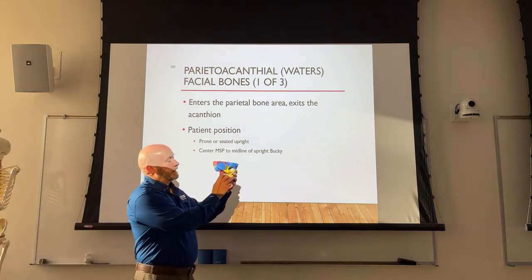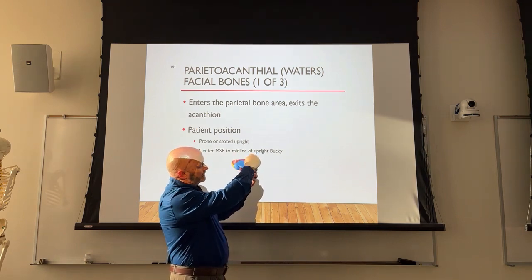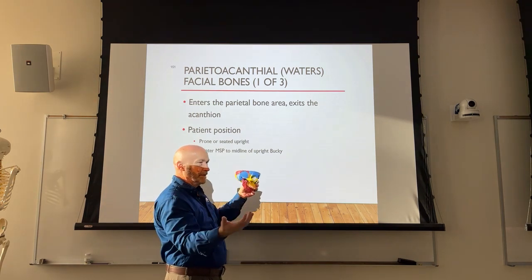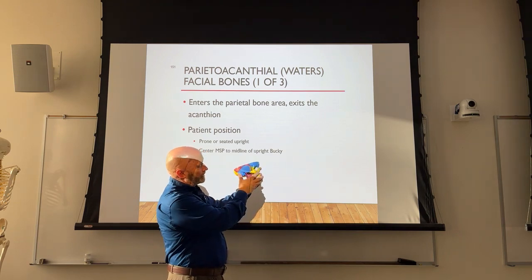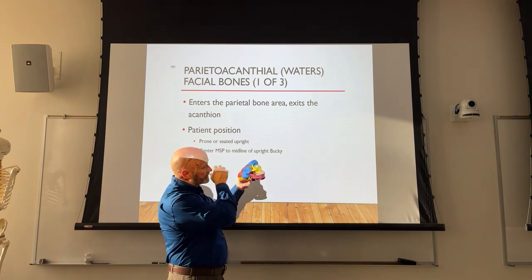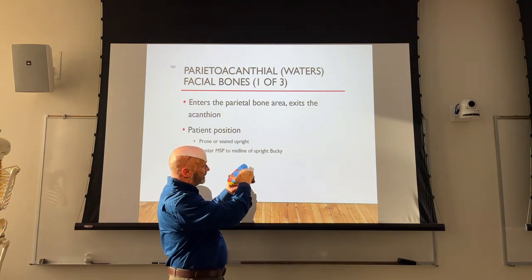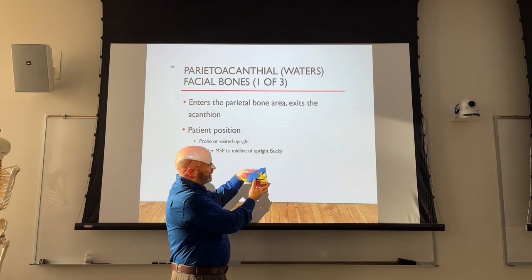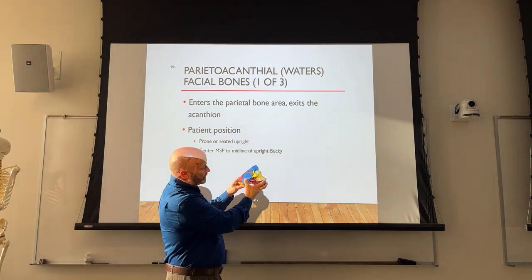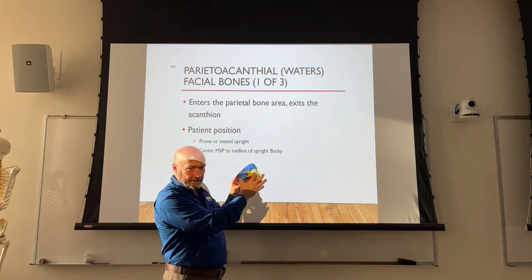Okay, so again, in Caldwell, what we're looking at is a 15 degree angle, right? And that's going to press the petrous ridges down into the lower third of the orbit. 15 degrees to 37 degrees, there's quite a bit of difference there. The difference in perspective is between the orbital meatal line and the image receptor. In this case, what's going to happen with the petrous ridges, which are right here on the inside, is it's going to drop the petrous ridges all the way below the inferior portion of the maxillary sinuses.